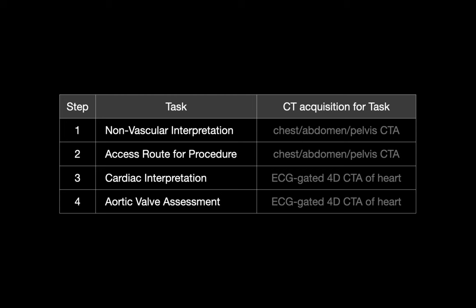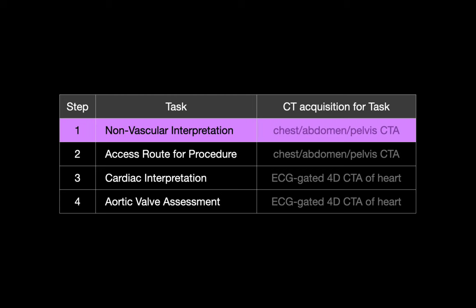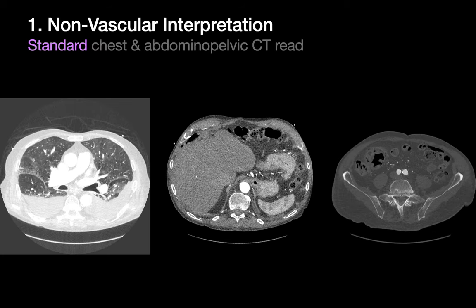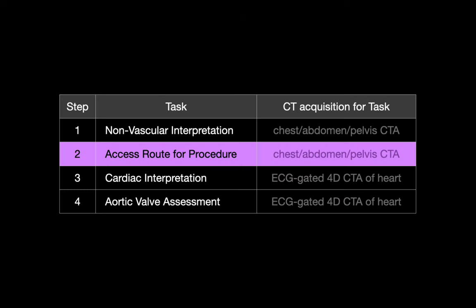Your interpretation of a TAVR planning CT study begins with a standard non-vascular read of the patient's chest and abdominal pelvic CT — tasks like counting lung nodules, checking out the liver, looking for bone lesions, and so on. Once you've completed a standard non-vascular read of the chest and abdomen, you're ready to begin assessing the intended access route for the patient's TAVR procedure.